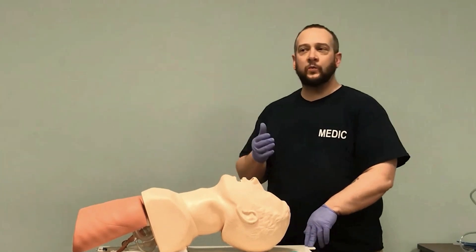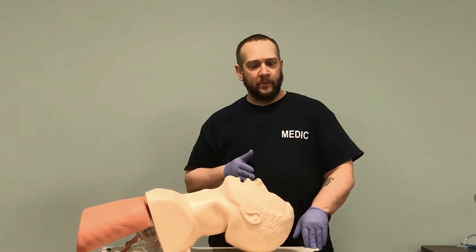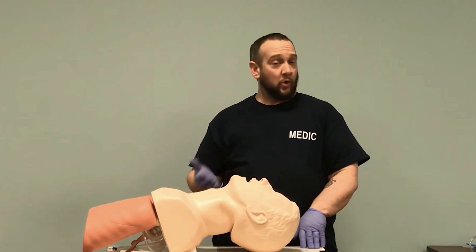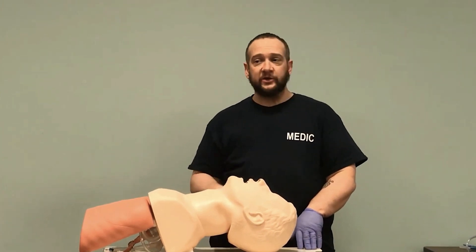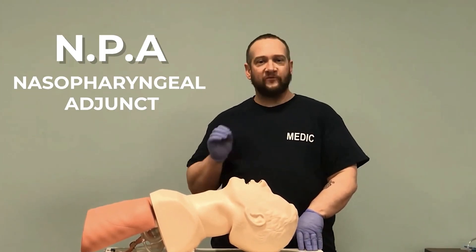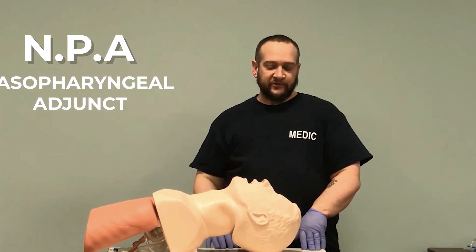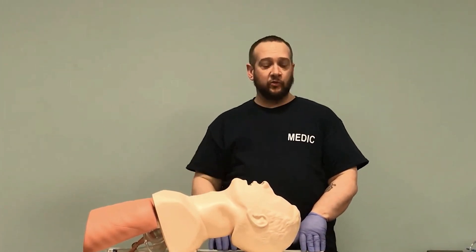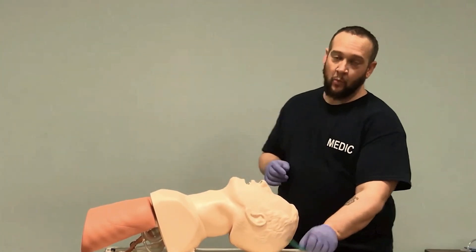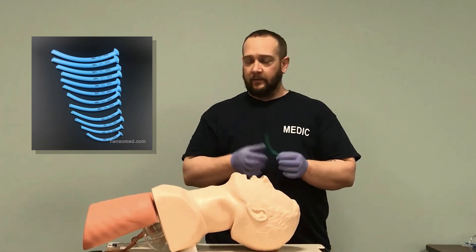If we had contraindications to our OPA, or if our patient is still semi-conscious or conscious, we can use our NPA. The NPA stands for nasopharyngeal adjunct. When we look at this, it's going to go up through the nostril — we're looking at one nostril — and these come in different sizes.